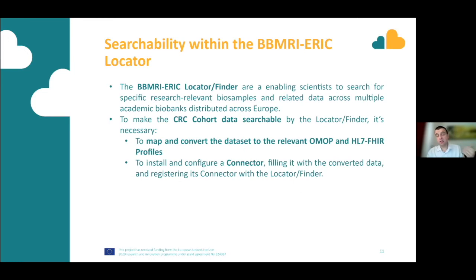And this is where the data is made queryable and the data is made accessible, because then once discovered through the BBMRI directory or through the locator or finder, you can request access to the pseudonymized data. Which requires all the steps necessary for transferring personal data, meaning signing the MTAs or DTAs, depending if you're asking for data only.